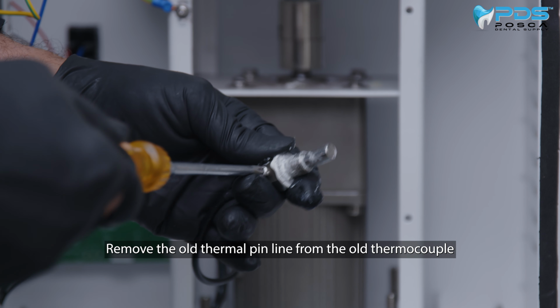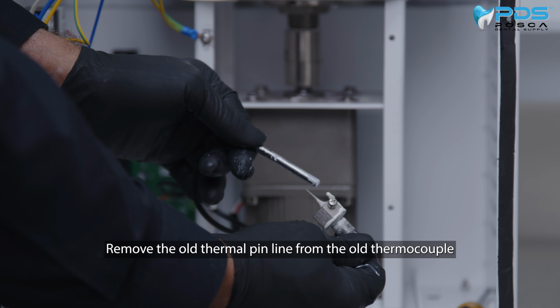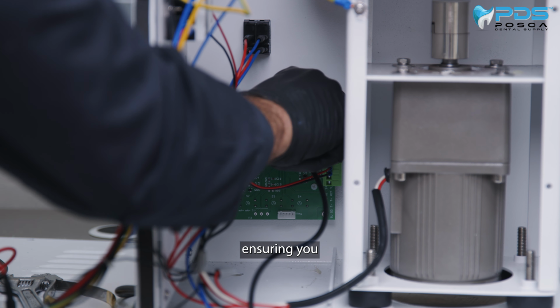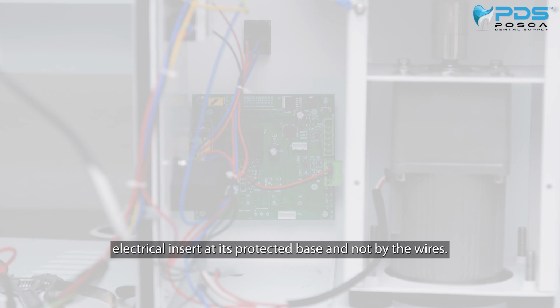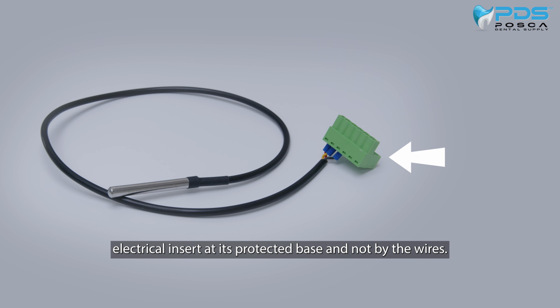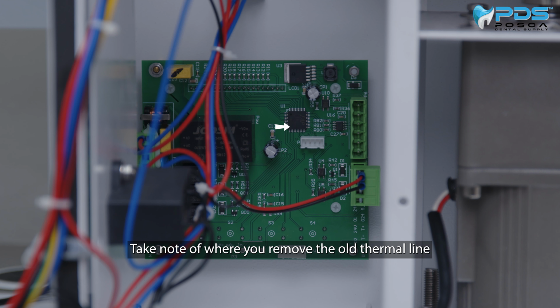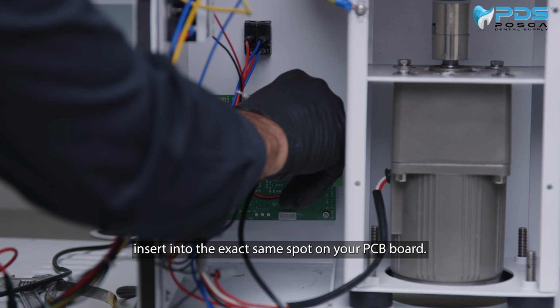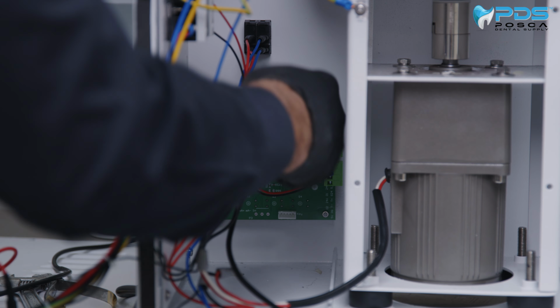Remove the old thermal pin line from the old thermocouple and remove the line connection from the PCB board as well, ensuring that you grab the thermal line electrical insert at its protected base and not by the wires. Take note of where you remove the old thermal line insert from and place the new thermal line insert into the exact same spot on your PCB board.